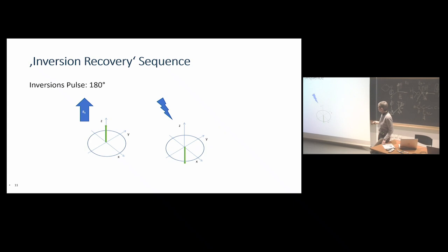This means that the spins here won't like to stay there. They will try to go back to equilibrium. The thing is, do you remember that little frog? Can we observe this phenomenon?